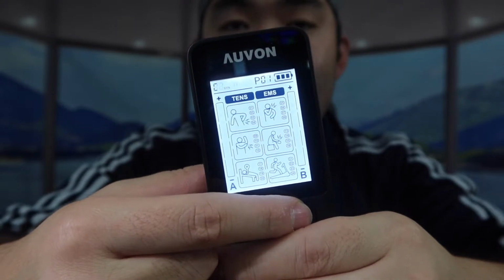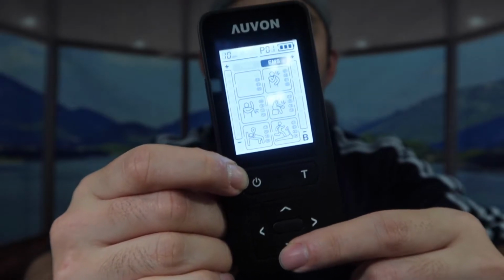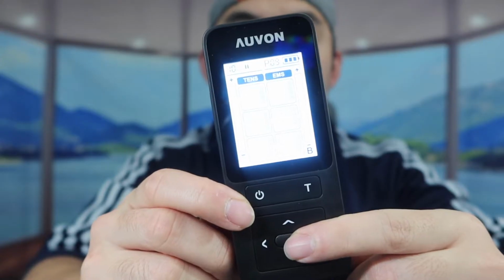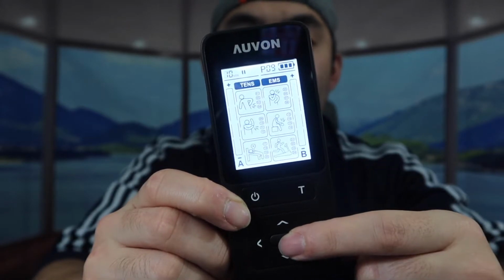So the maximum is 90 minutes. If you guys want to select which mode you want to use, you can basically use the arrow keys on the bottom. Alright, so definitely select whatever you guys want. And once you guys decide on which one you want to use, you basically want to press the button right here, and then basically the product starts working.